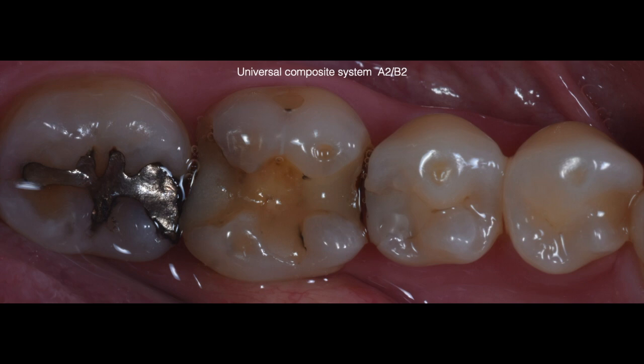Now let's look at what I consider my single shade for all posterior teeth I restore: Brilliant Everglow A2B2. For this patient I am going to do multiple restorations in a single appointment.